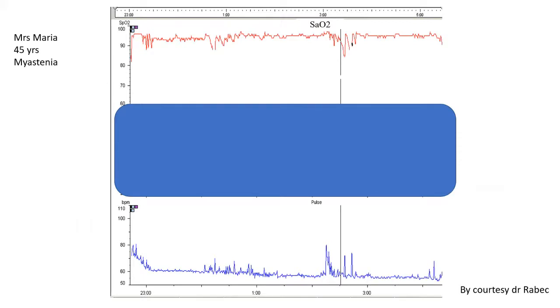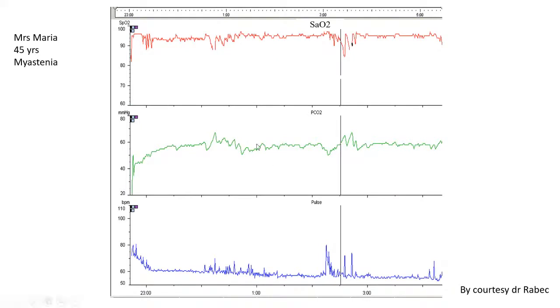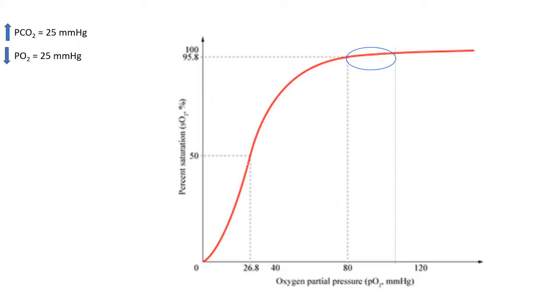Pulse oximetry is not always sensitive in detecting hypoventilation. Consider Mrs. Maria, 45 years old, affected by myasthenia, ventilated during the night. If I monitor my patient with the oxygen saturation profile, apart from a few desaturations, this looks like a good profile. But if I add transcutaneous pCO2 monitoring, the mean pCO2 is higher than 55 mmHg — so there is actually residual hypoventilation.